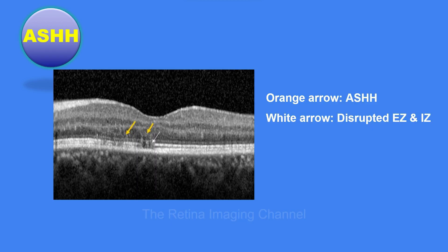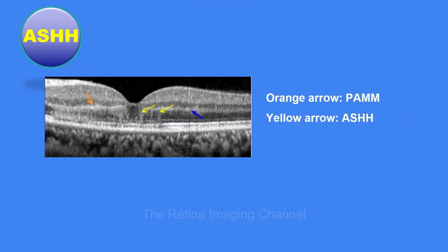Finally, let us see a couple of examples of ASHH in other retinal diseases. The first OCT scan shows hyperreflectivity of OPL and ONL in an angular fashion, marked with an orange arrow, and disruption of EZ marked by a white arrow — this is a case of ASHH due to blunt trauma, not AMN. The second image shows paracentral acute middle maculopathy (PAMM), with hyperreflectivity of the inner nuclear layer marked by an orange arrow, and a nicely visualized hyperreflective Henle fiber layer marked with yellow arrows along with disrupted EZ underneath. This is a case of PAMM with ASHH.